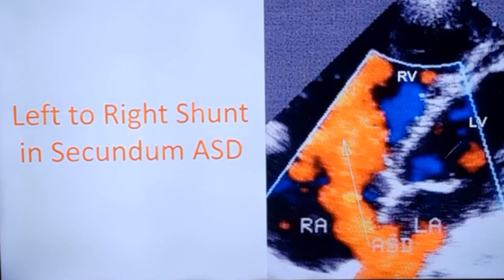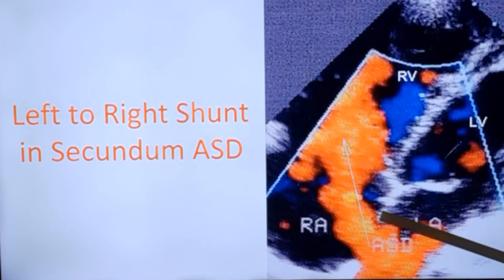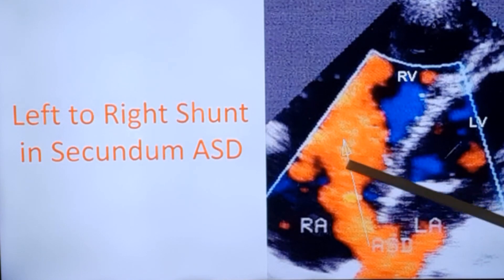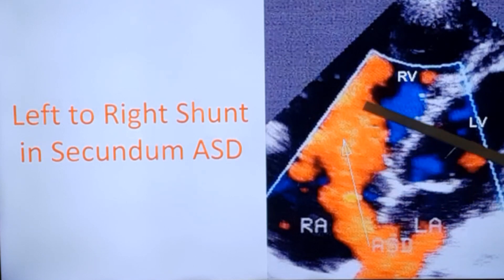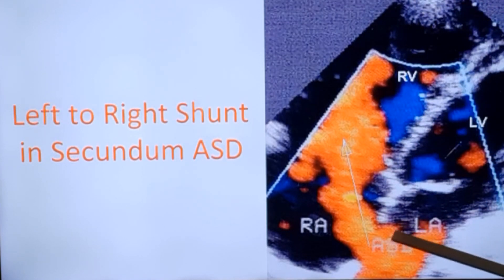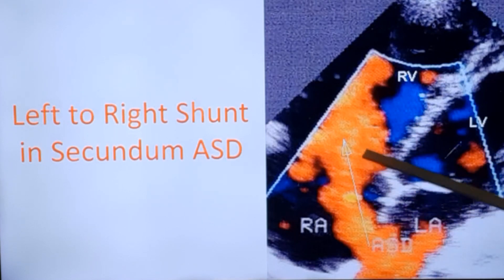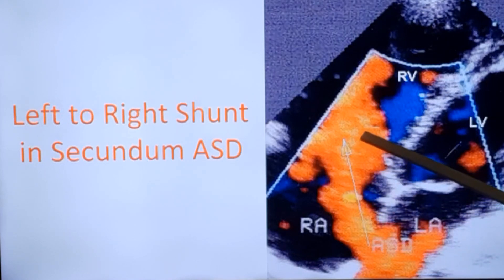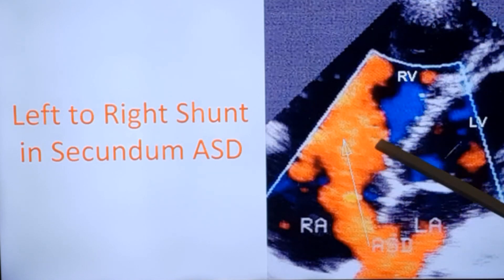Moving from two-dimensional echocardiographic images to color Doppler imaging — this is again the atrial septal defect. You can see a left-to-right shunt colored red, because the blood is moving towards the transducer. In color Doppler echo, red is the color coding for flow towards the transducer — from the left atrium across the ASD into the tricuspid valve and right ventricle, so the flow is almost directed towards the transducer.